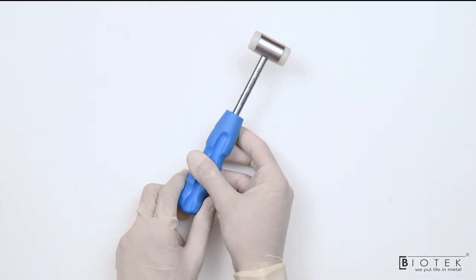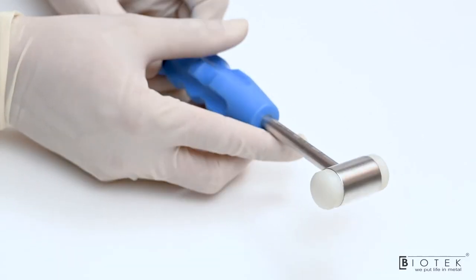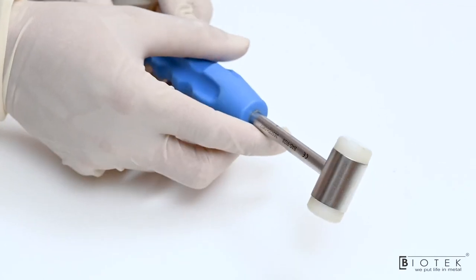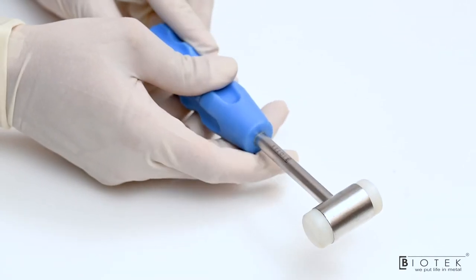This is hammer. It is used for insertion of punch and the punch tap inside the bone and for the anchor insertion.